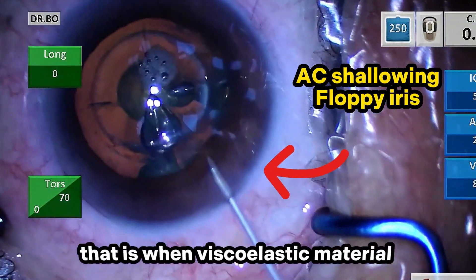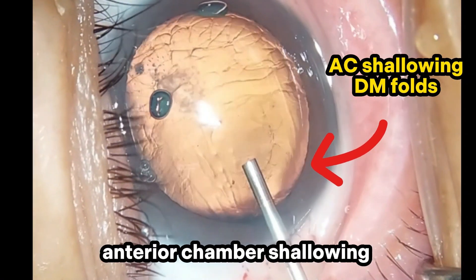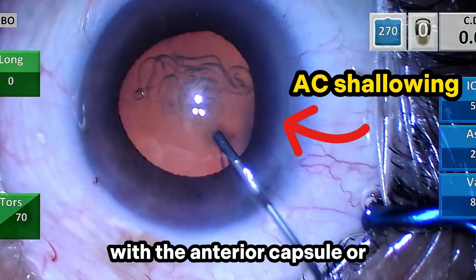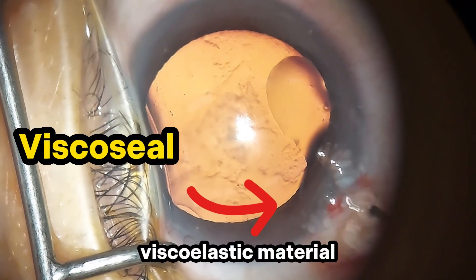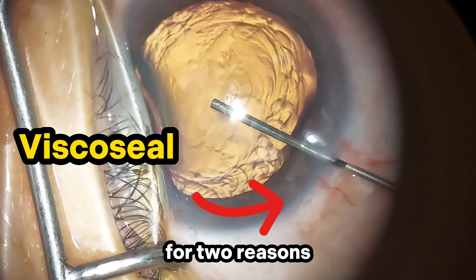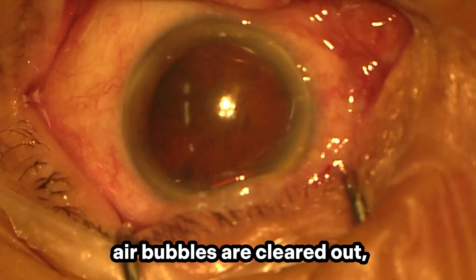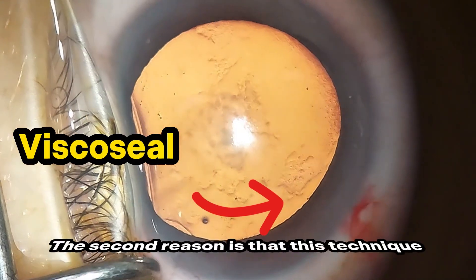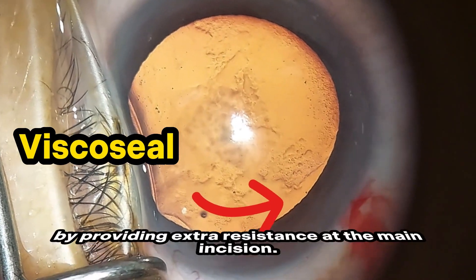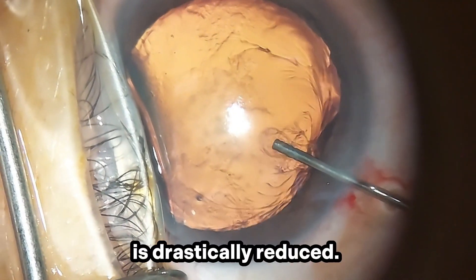There's one problem I occasionally encounter: when viscoelastic material is pushed too slowly from the main incision, or my cannula is not angled correctly, a certain amount of anterior chamber shallowing may occur and inadvertent contact with the anterior capsule or the endothelium may ensue. That's why I developed the Viscoseal technique, which involves covering the main incision with viscoelastic material before entering the anterior chamber. This reduces the speed of aqueous outflow by providing extra resistance at the main incision, so even if the cannula is angled incorrectly, there's less chance of anterior chamber collapse.